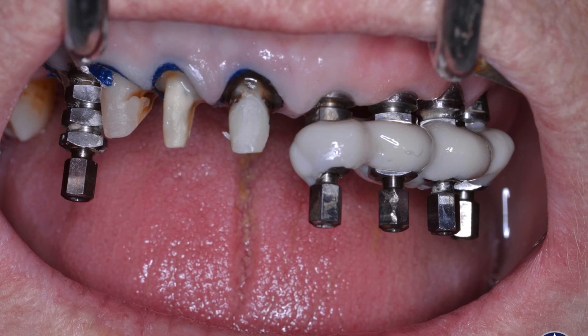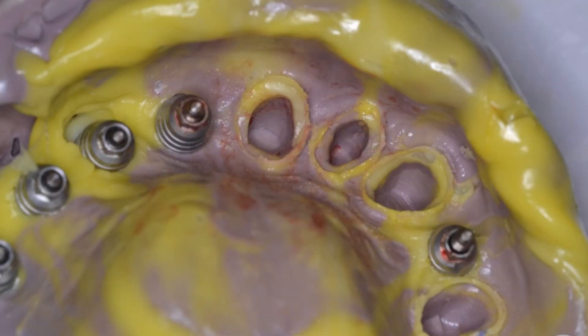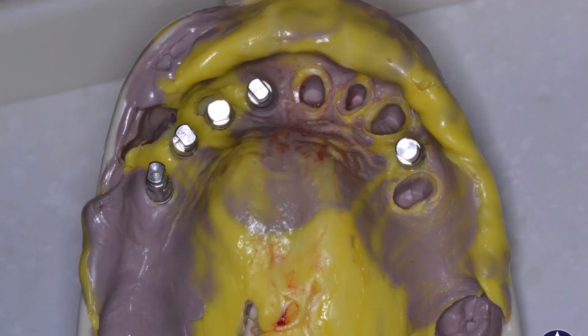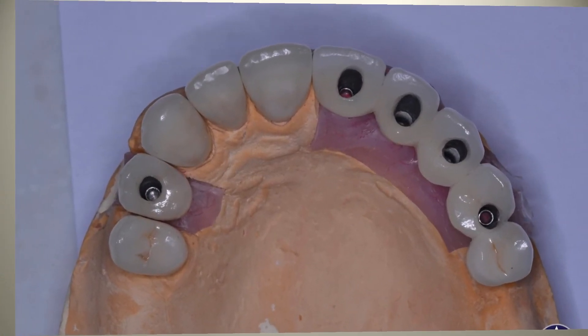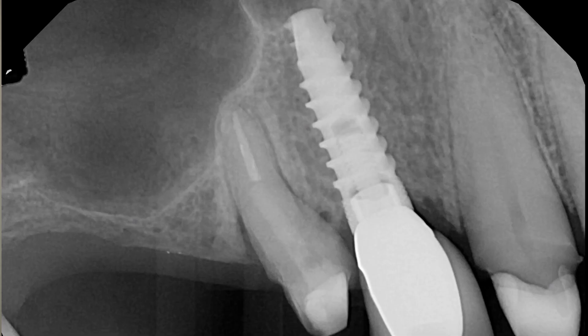One colleague argues that triad or polymethyl methacrylate used in small increments is acceptable as well — whatever works best for you. We go ahead and take a fixture-level open tray impression for the implants and crowns. This gets poured up by the lab after adding the implant analogs. The vertical orientation of all the implants is confirmed, and after appropriate mounting on models using a face bow with proper occlusal records, the lab sends back the porcelain work for review on the model.